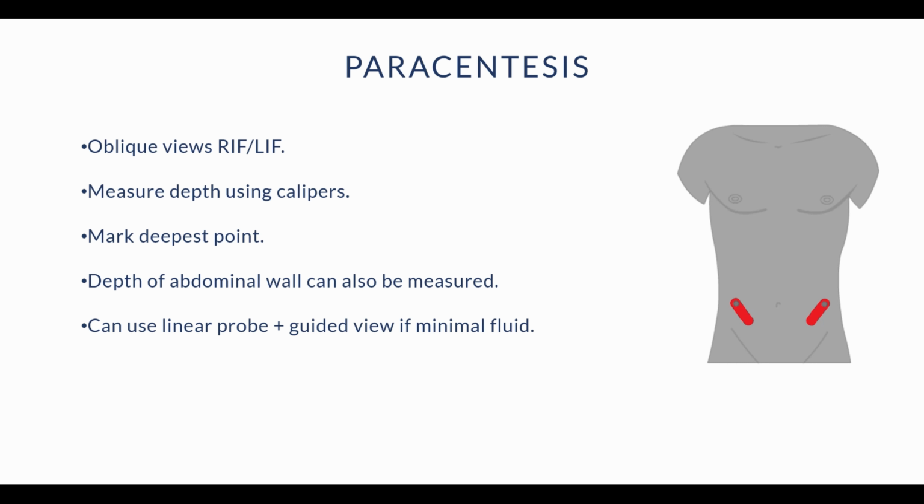If minimal fluid is present, the linear probe may be used to guide the needle insertion in a similar way to ultrasound-guided vascular access.